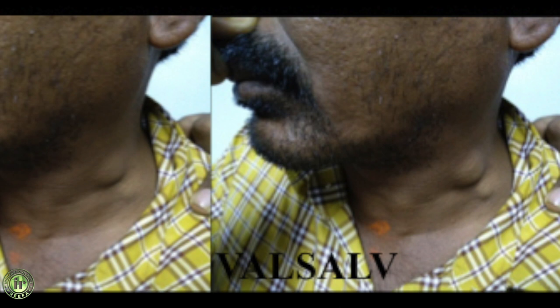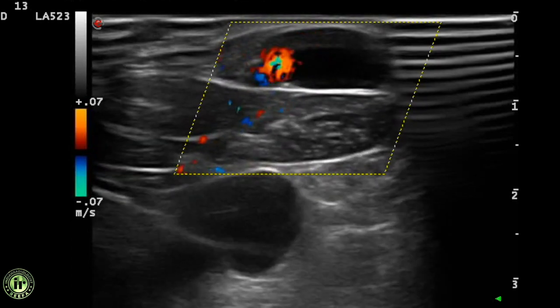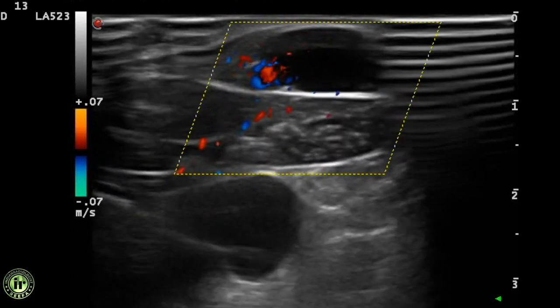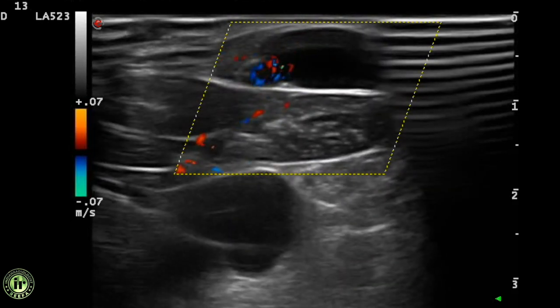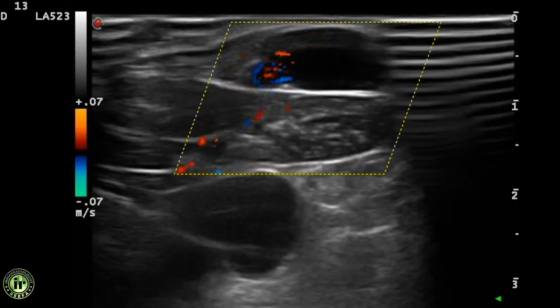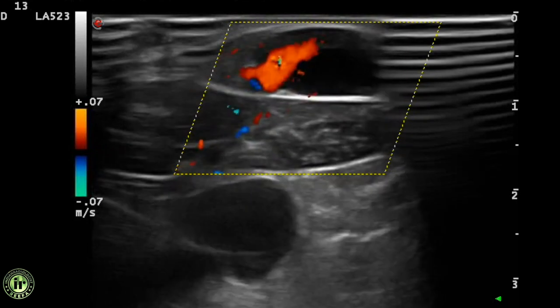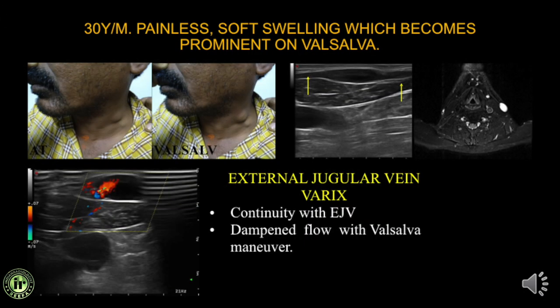A 30-year-old presented with a painless swelling over the neck that becomes prominent on Valsalva. Ultrasound clearly demonstrated the swelling was an expansion of the external jugular vein. During Valsalva, flow into the swelling ceases, and when the patient releases pressure the flow returns. MRI was also performed and confirmed, by comparing both sides, that this was a vena varix.